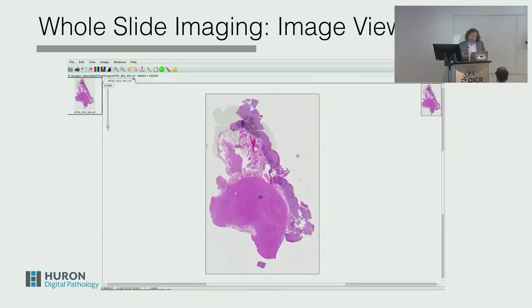And after you get an image, then you have some sort of image viewer, image management system, then you can do the usual stuff. This is where it gets really interesting, because now the tissue, the specimen, is in the computer. Now the entire repository of computer vision and more recently artificial intelligence is available. Now we can do really nice things with the image, and hopefully we can take some of those burdens, laborious tasks that we should not assign to the pathologist, and assign them to computers.